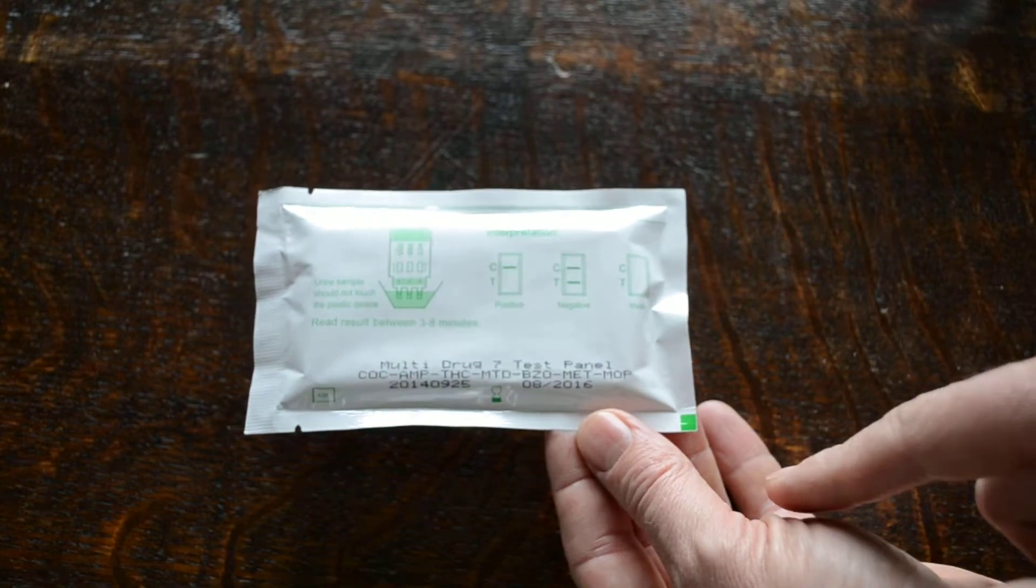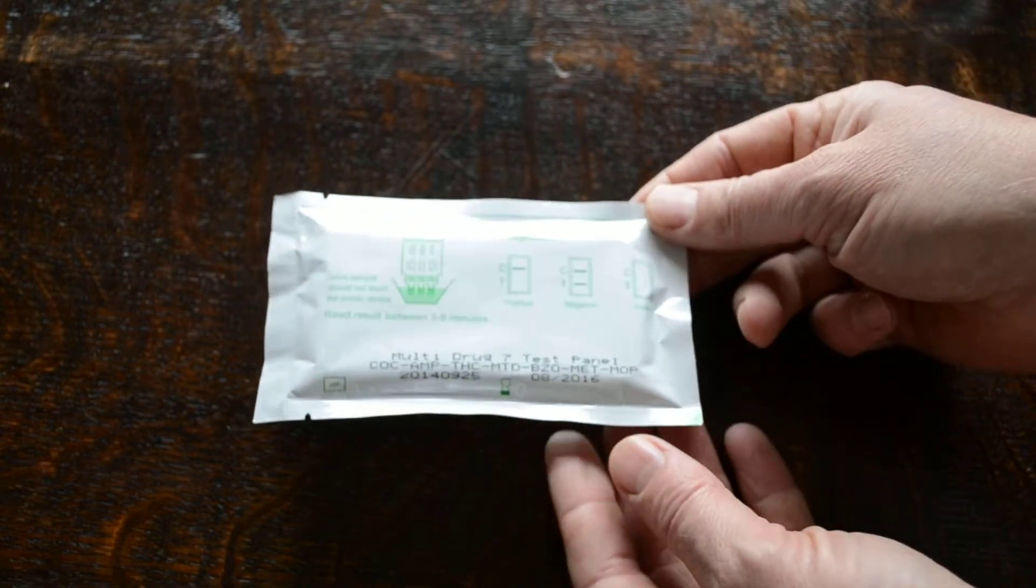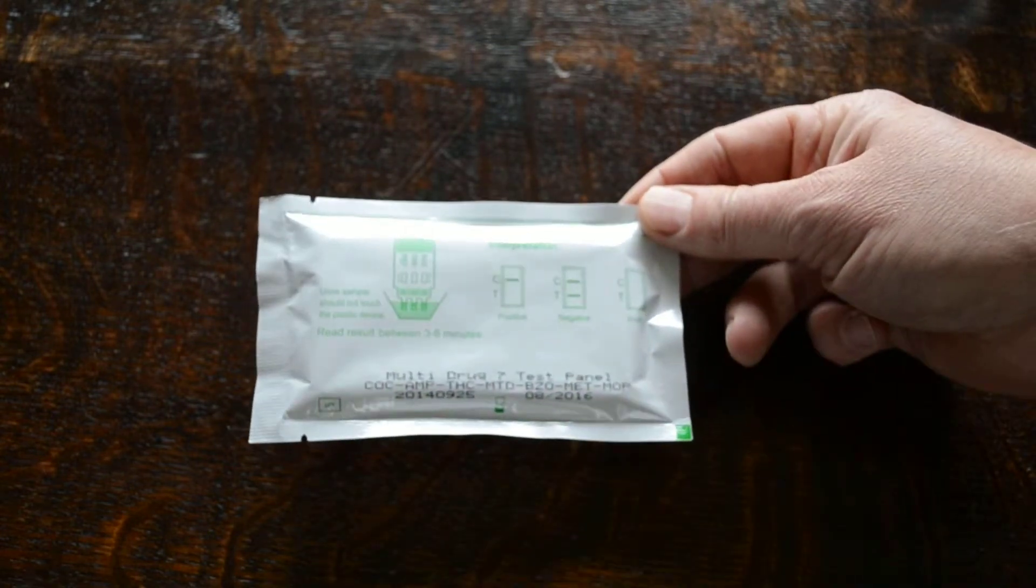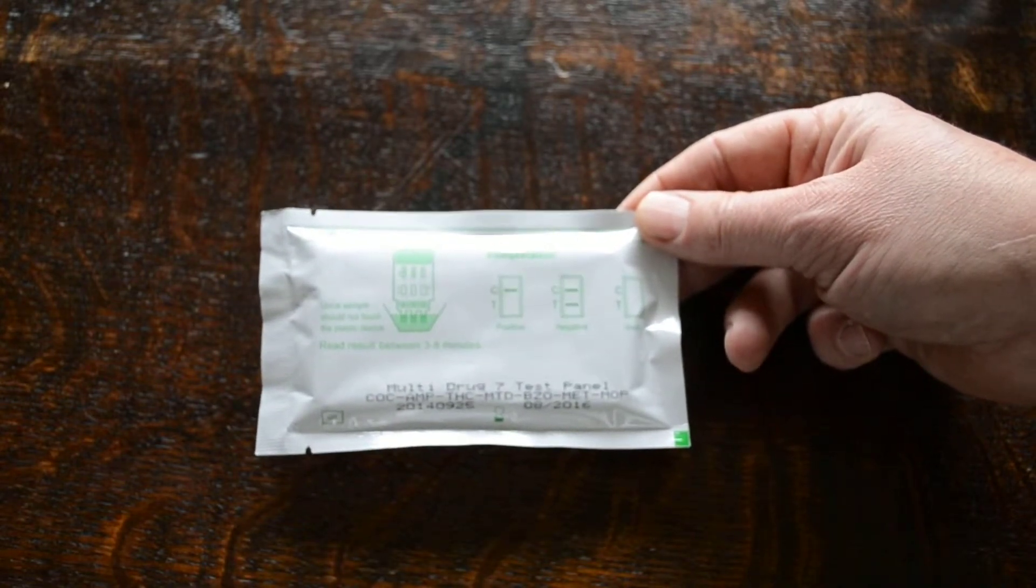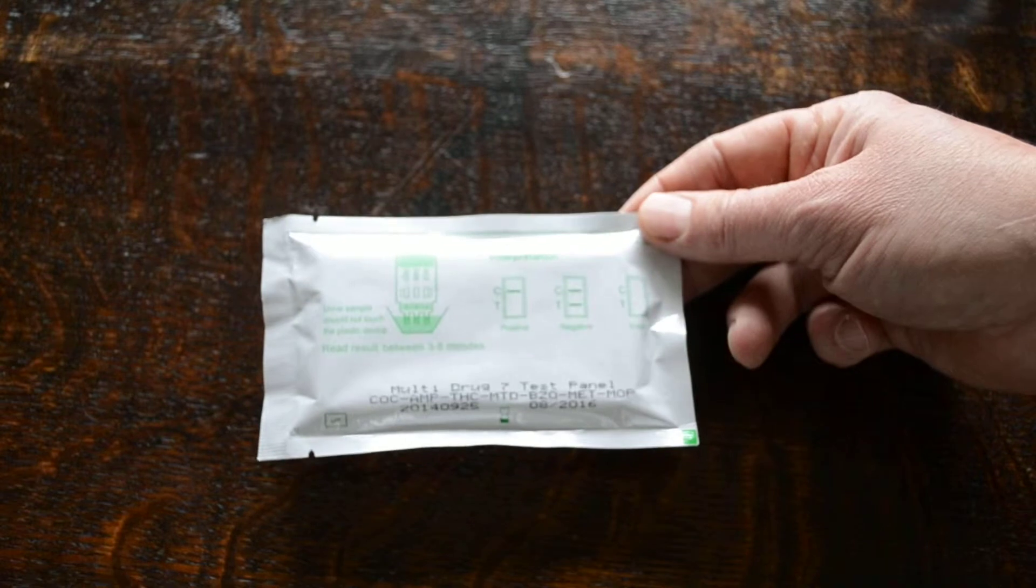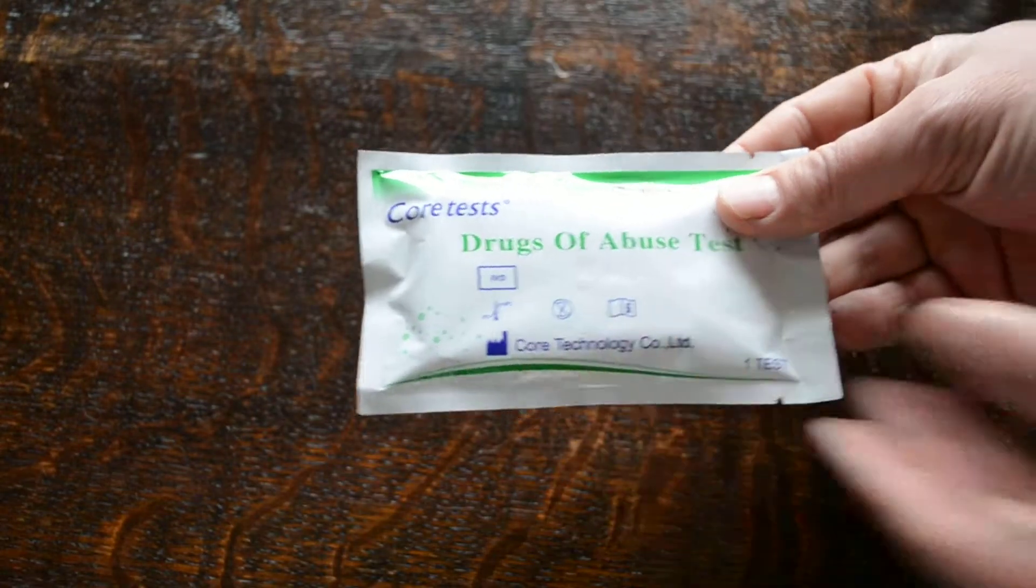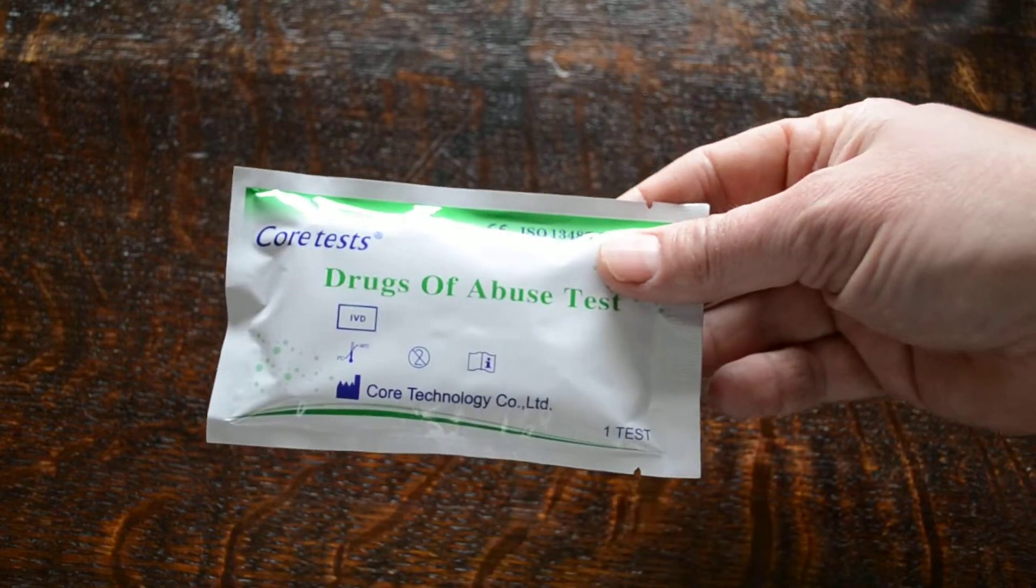Also gives you inkjet printed on here the combination of tests. This particular combo screens for cocaine, amphetamine, cannabis, methadone, benzodiazepines, methamphetamine, and opiates. You'll also have a lot number and an expiry date, so it's nice and easy to check what you've got before you run the test.